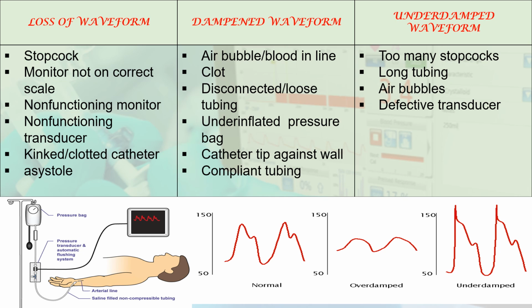Then another situation is the monitor is not on the correct scale. Then also it leads to loss of waveforms. Other factors that lead to loss of waveforms are non-functioning monitor, non-functioning transducer, kinked or clotted catheter and asystole. These are certain reasons the monitor shows loss of waveforms.